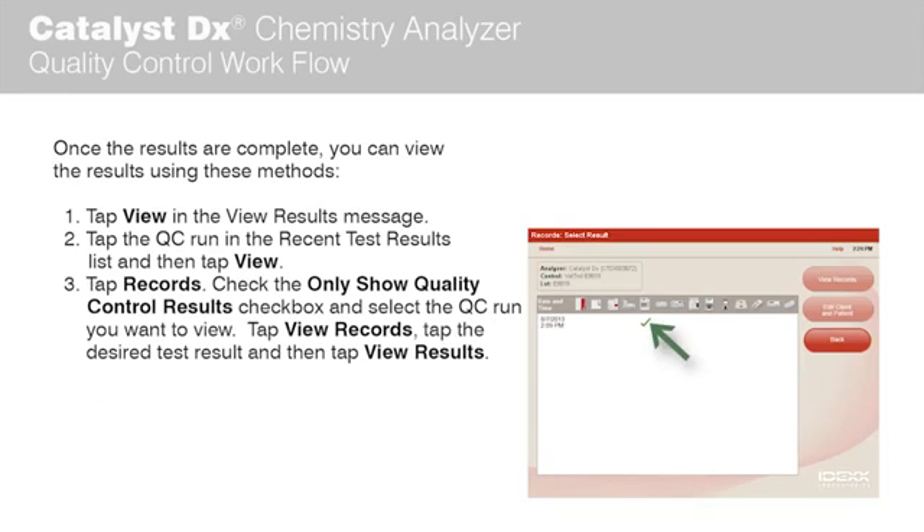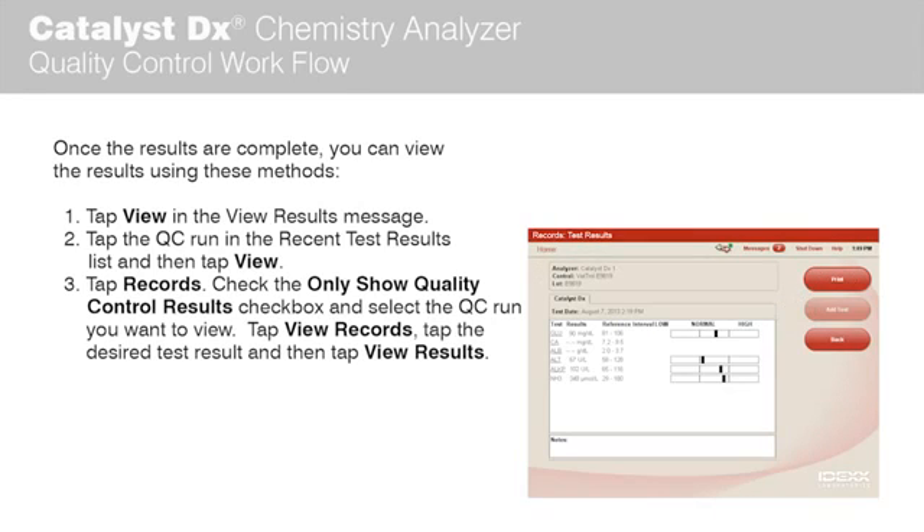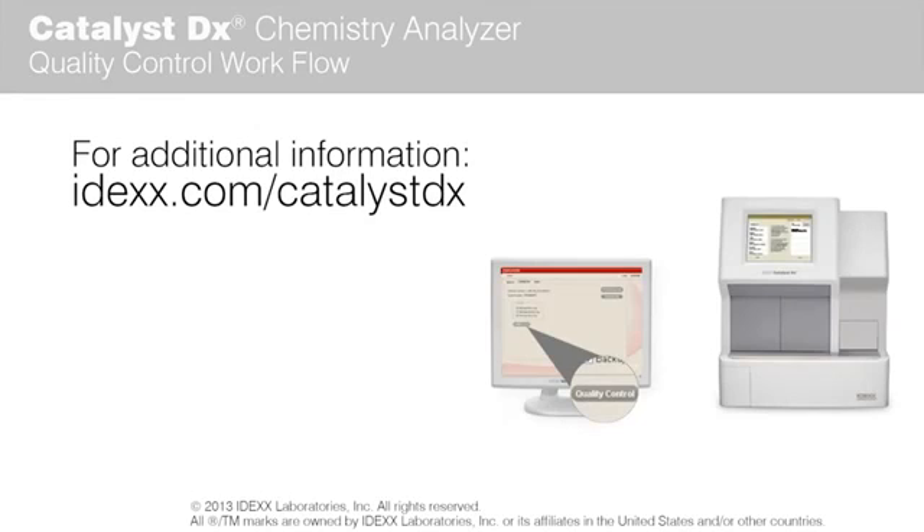Tap View Records, then tap the desired test result, and then tap View Results. For more information about the Catalyst DX Chemistry Analyzer, please visit IDEXX.com/CatalystDX.